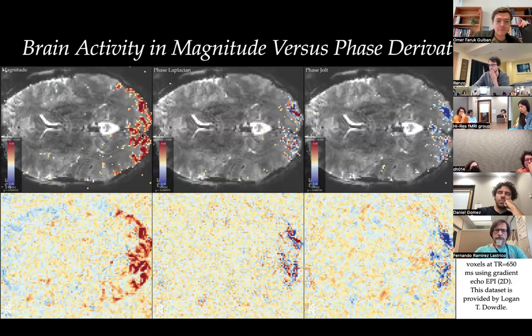So I suspect that there is some effect that only happens in the very early echoes. If you take that ISMRM abstract, you have to think that something with regards to conductivity or electrical fields in the white matter is somehow giving rise to phase fluctuations to such a degree that you can detect them in the second spatial derivative of it.